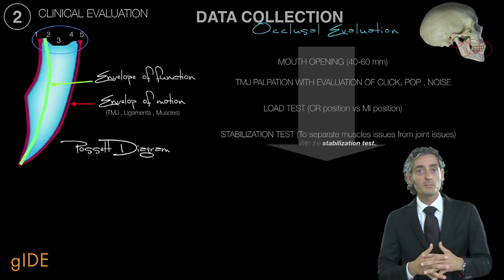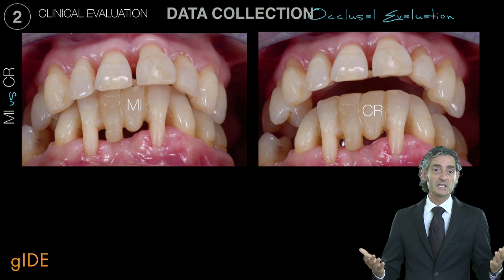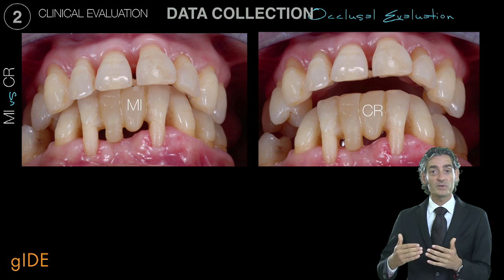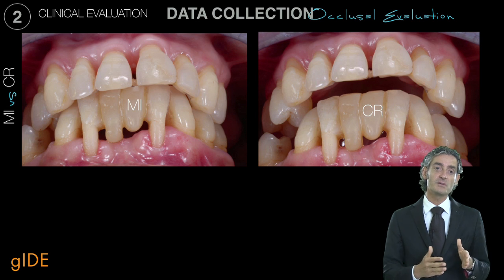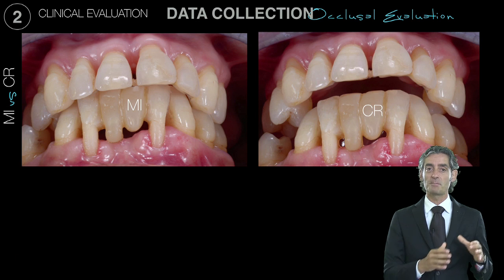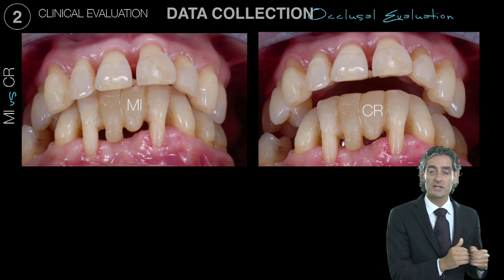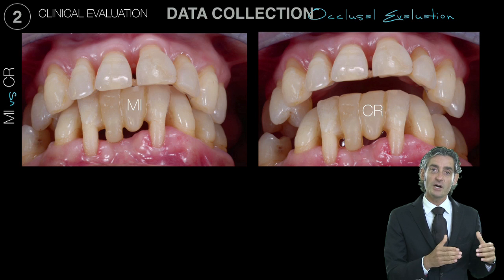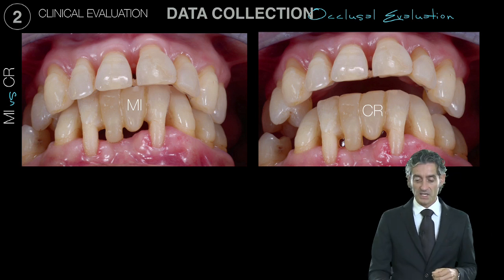And so for us it's really important as the starting point, because in a case like this, where for example we have to evaluate a full mouth rehabilitation with the use of implants, and then we want to create a new provisional restoration for the time in which we are going to place the implants, look at which huge difference there is between the maximum intercuspidation and the CR position. If we are going to use the maximum intercuspidation, for sure it will be a problem to fix the provisional restoration later in the right position. If we prepare the new provisional restoration in the CR, for us it will be really easy to find this position back at the time of the surgery. So for us it becomes really important.